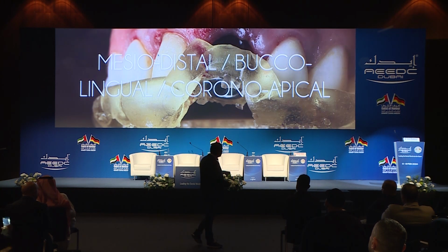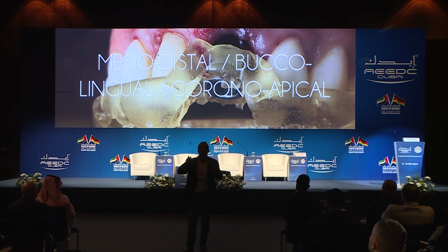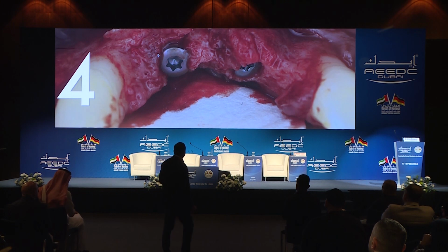Always when you place your implant in a 3D positioning, you have to respect this 3D positioning. Stay away from the tooth 1.5. Place your implant 3 to 4 millimeters from the future gingival margin, and always toward the palate.